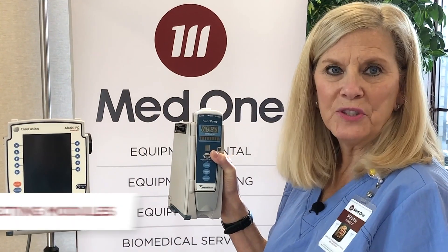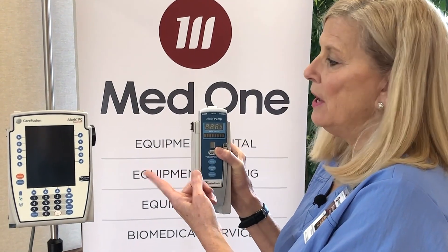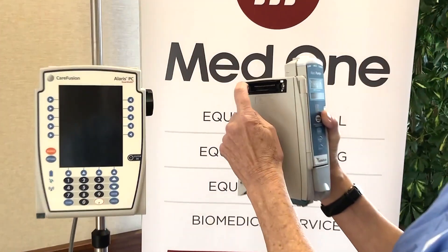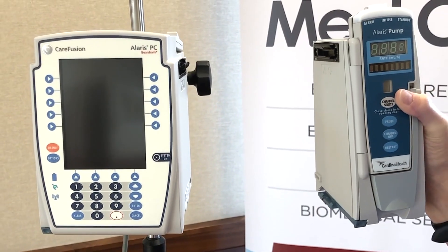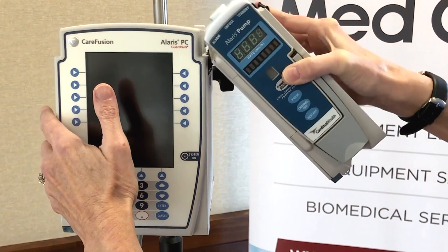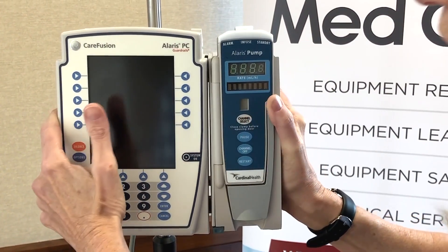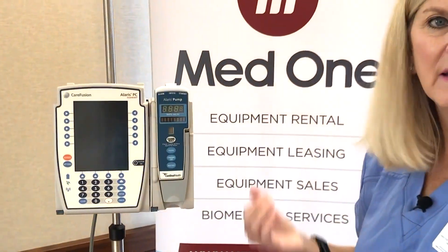I'm going to demonstrate attaching the Alaris large volume pump module to the point of care unit. You want to make sure that the groove on the side of the large volume pump connects with the IUI connector — this is what gives the connectivity for the pump and the brain to work. Cock it at a 45-degree angle, and when you have it in place, you want to hear a click so that you know connectivity is achieved.